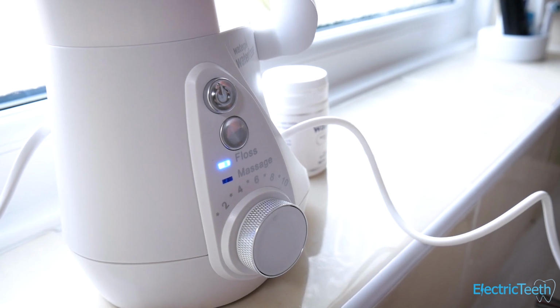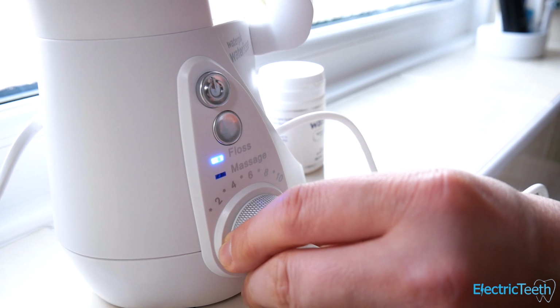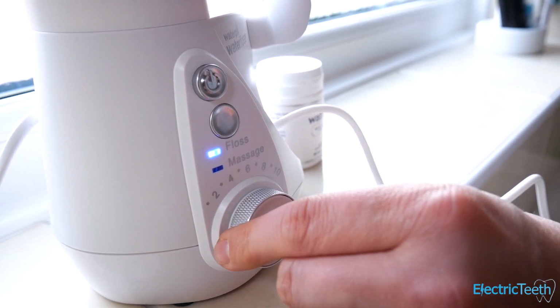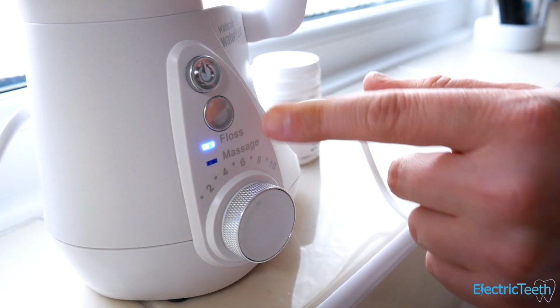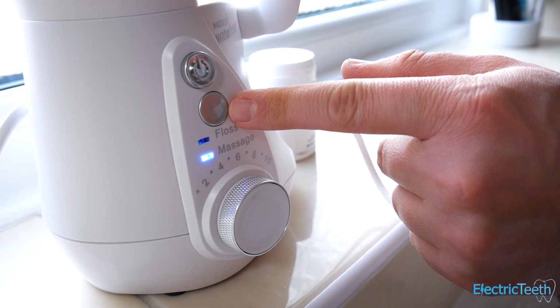You've got 10 different settings ranging from 0 to 10. You just control that via the rotatable knob on the front of the unit. So that varies from 10 through to 100 PSI. Most people are going to find somewhere about 6, 7, 8 is the ideal pressure setting. 10 is really powerful.